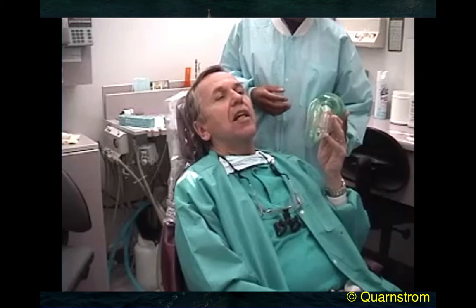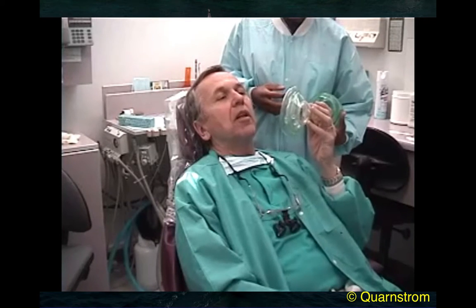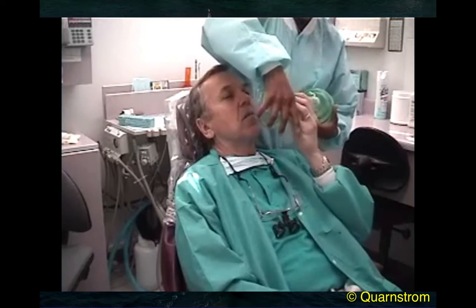Now, one of the things you have to be sure you establish is a good seal with the mask. So in that case, she was actually down a little too far, and when she squeezed, she would feel that she wasn't inflating my lungs. So let's try again with the mask a little higher.